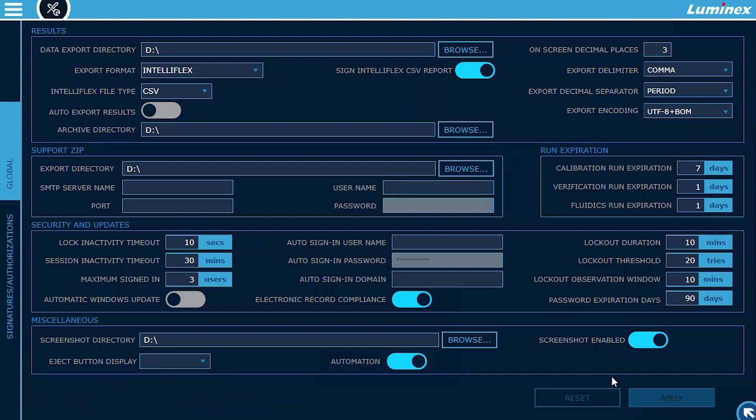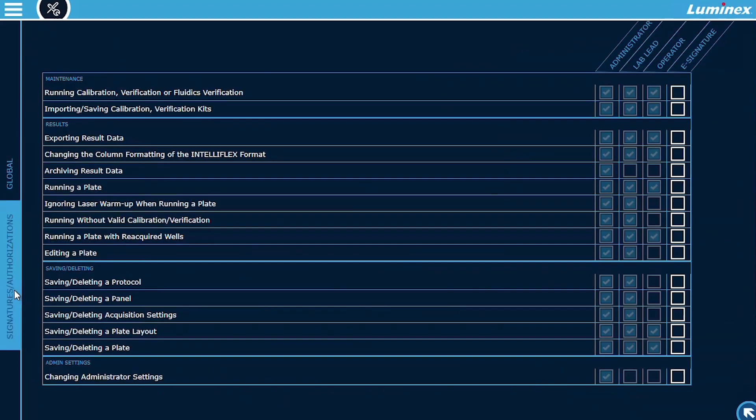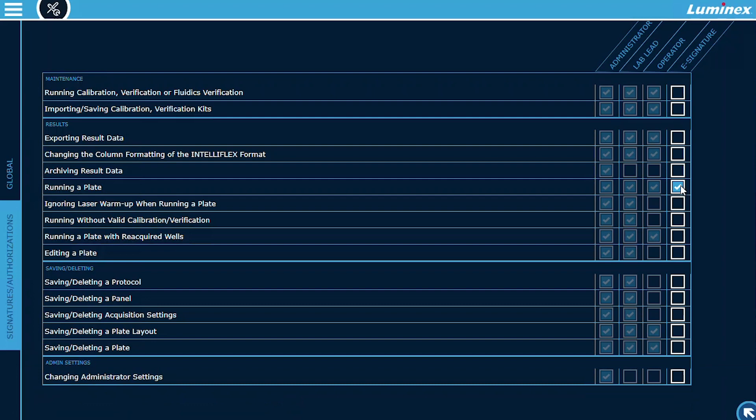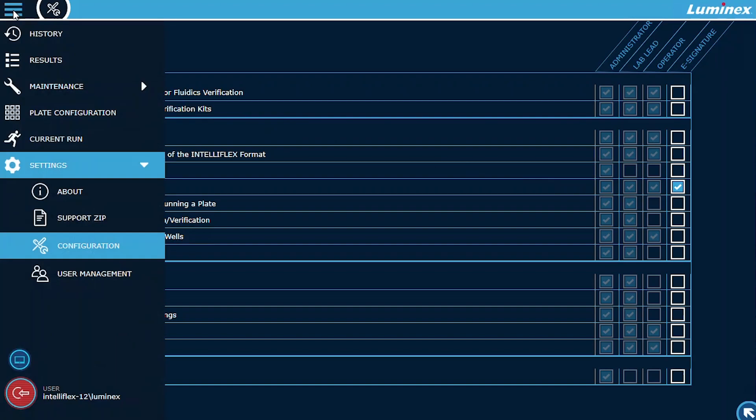Some of the features enabled with this module include electronic signatures and digital signatures. Electronic Signatures. XMAP IntelliFlex Software enhances traceability by allowing administrators to require electronic user signatures when executing specific actions. These actions are customizable for different regulatory environments and require users to re-enter their credentials for each signature.